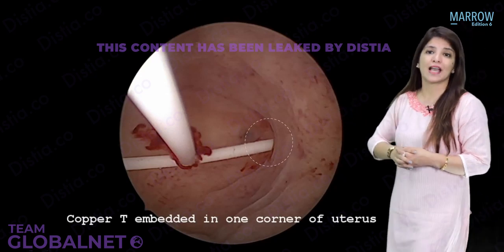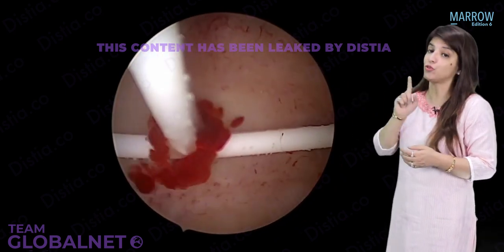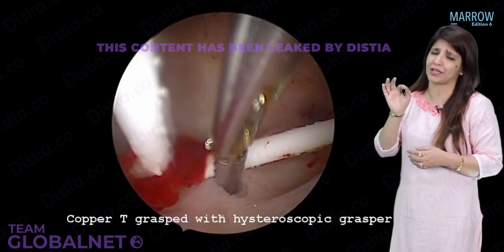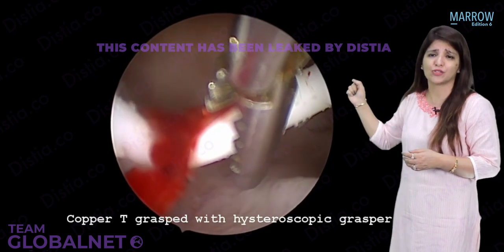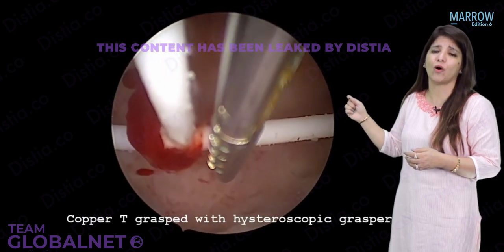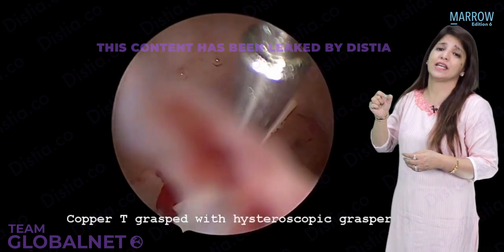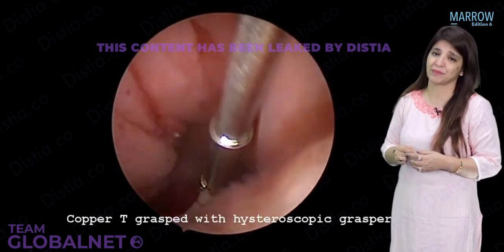Because the arm of the copper T is going inside the ostia, I will have to remove this copper T. With a simple instrument, a hysteroscopic grasper, I have gradually dislodged the arm from the ostia. Once the arm has been dislodged, I am going to slowly and gradually take out the copper T with the help of this hysteroscopic grasper. Clear?